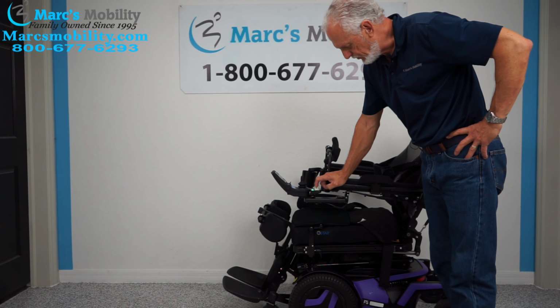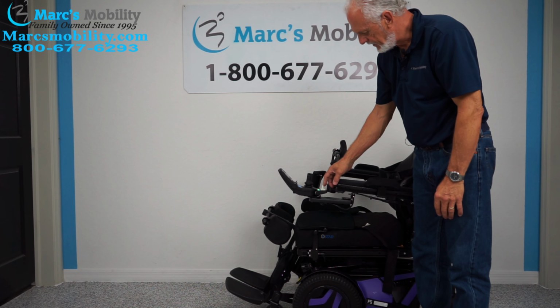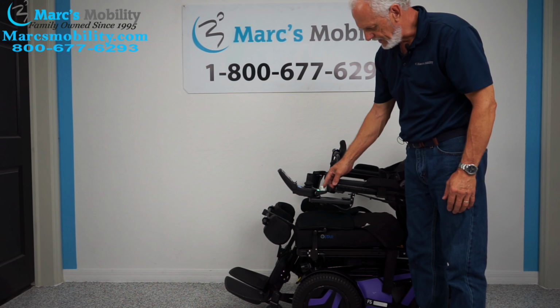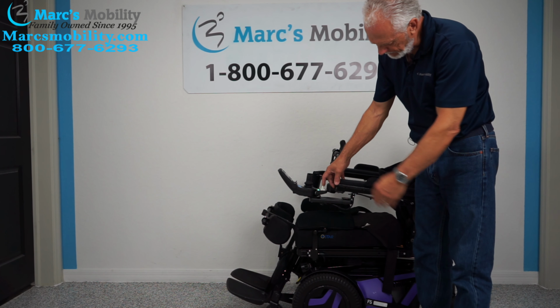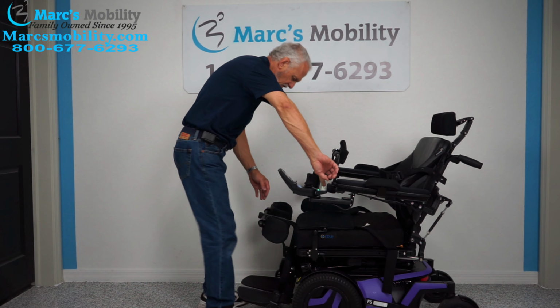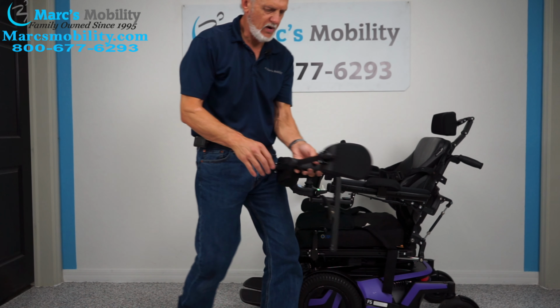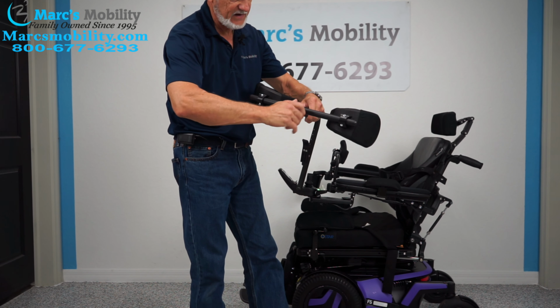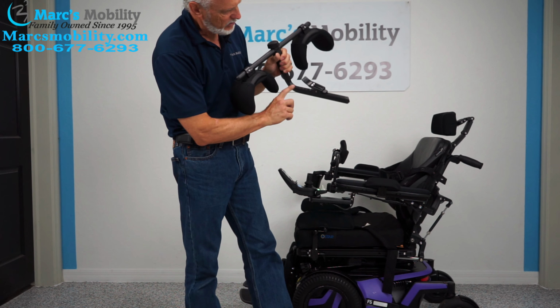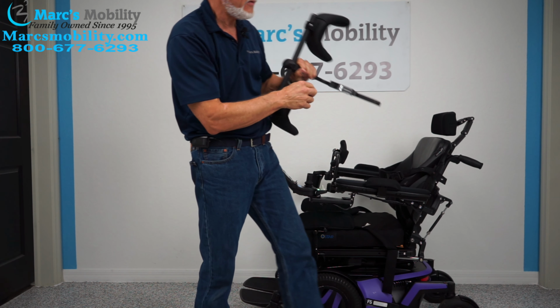And as I said, whenever you put the knee brace on, you have to have the feet all the way in. Like I'm gonna bring the feet in a little bit right now. It's a lot easier to put in, and then it comes out much easier. So this is your knee brace, and the knee brace is adjustable. So you can adjust it this way to make it tighter, and you can adjust the height by moving these screws. There's holes here. You can move it all the way down to the last hole, all the way up to the top hole if you have a short person.